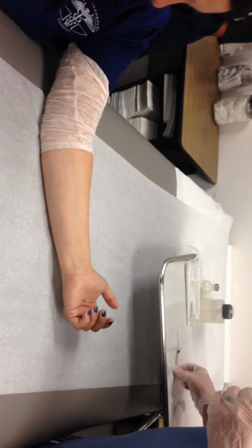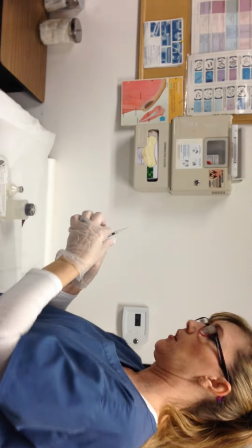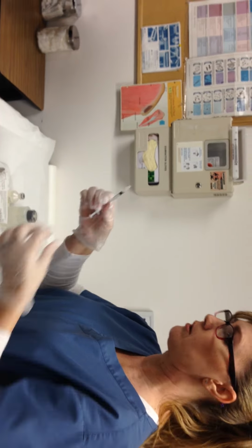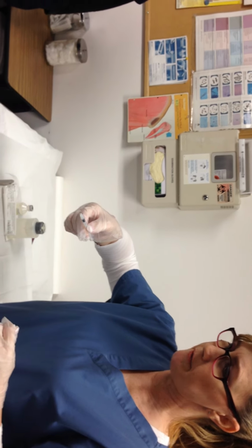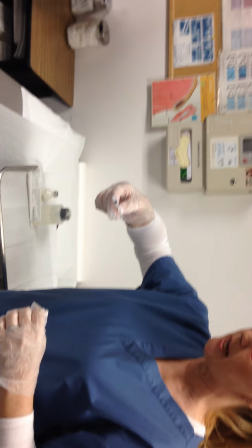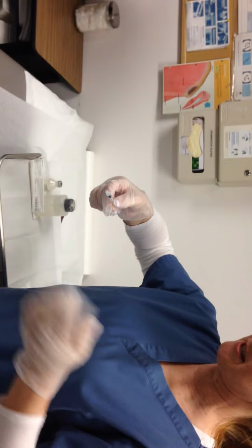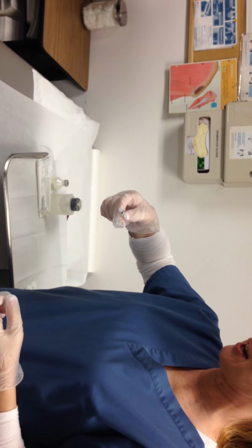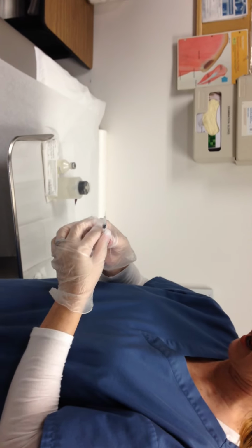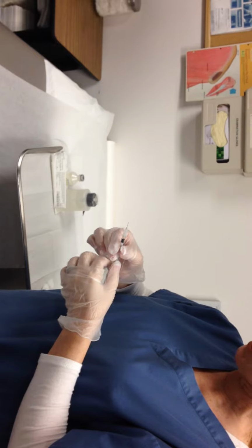Okay? Now, here's our needle. What is this? Rainbow. Thank you. Okay? Now, the bevel is up. Remember we looked at that? See the opening? That's that bevel. It's the opening to the needle, and it shines. It picks up the light. And it makes that noise too. You just can't always hear it. Okay, there it is. Okay. And I'm looking. Yep, my medication's in there. My bevel is up. Okay.